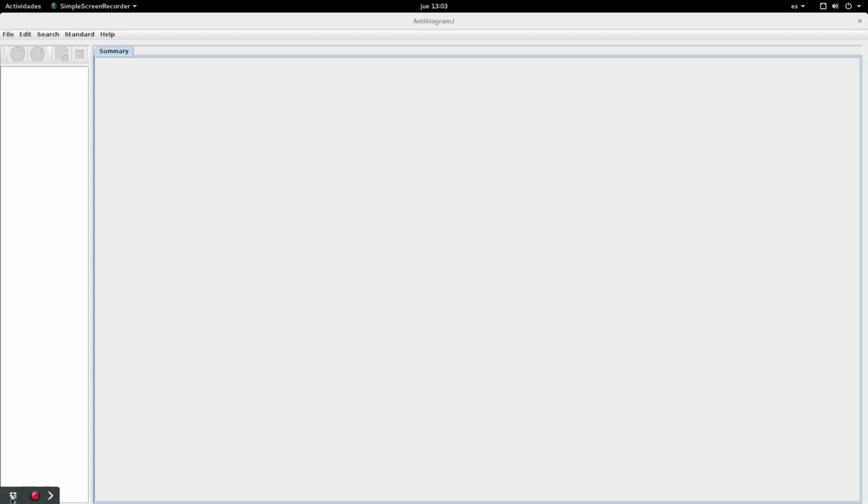In this video I will show you how to create a new experiment and add antibiogram images to that experiment in AntibiogramJ. So here we have the screen of AntibiogramJ. As you can see, it's empty.